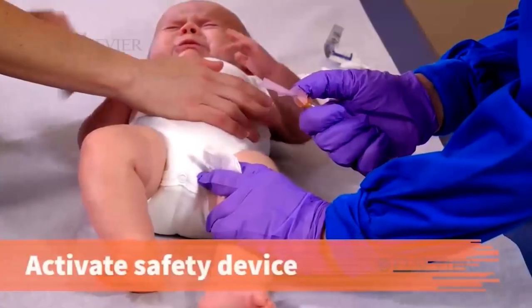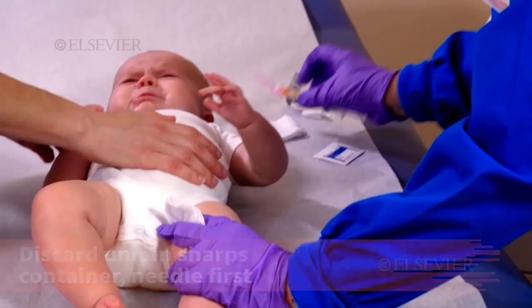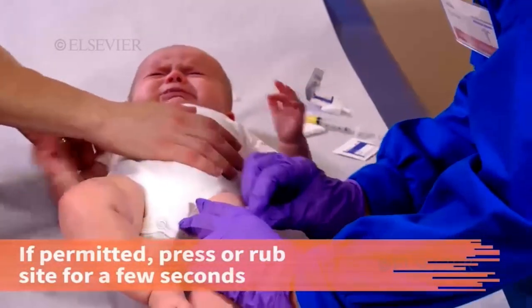Immediately activate the safety device and discard the unit in the sharps container, needle first. Massage helps increase absorption and reduce pain, but is not recommended for certain medications. Follow your facility's policy on massaging the injection site after drug administration. If permitted, press or rub the site for a few seconds.